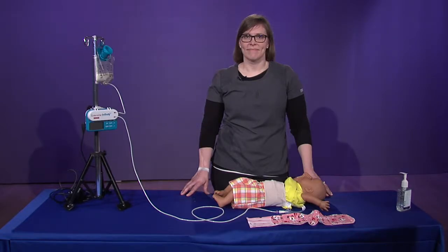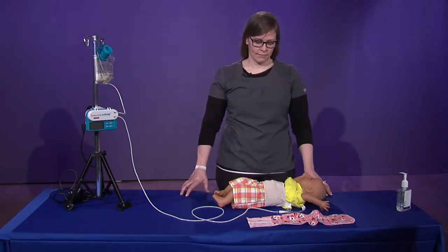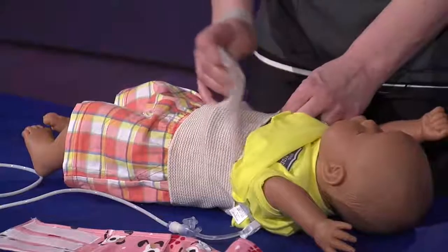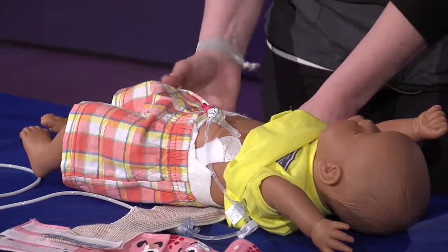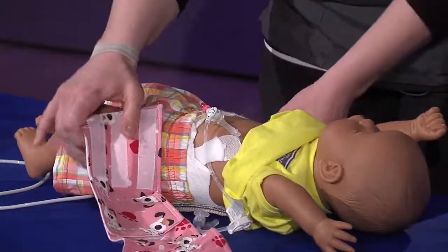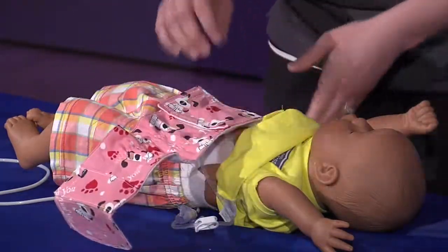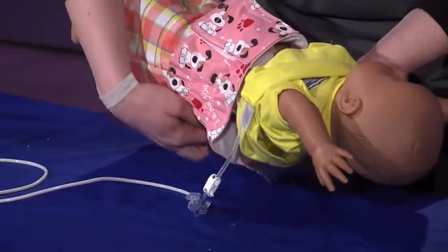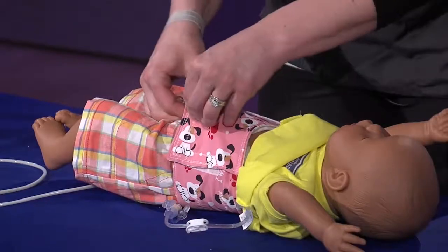For the first 3 months, please use at least 2 different ways to secure your child's G-tube. This will help to lower the chance of the G-tube getting accidentally pulled out. This is very important. In the hospital, we will be using a grip lock and a covering device to secure the G-tube to keep it from accidentally getting pulled out. Your child will leave the hospital with the grip lock and a covering device in place. Some examples of other covering devices are ACE wraps, abdominal binders, onesie, and G-tube belts.